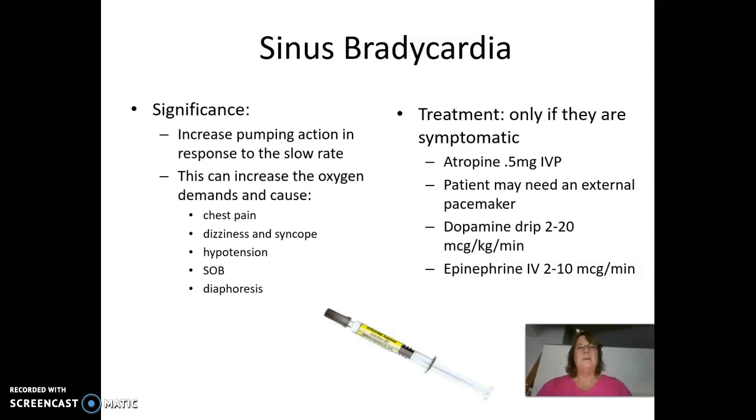Now, external pacemakers, I do want to say they're only meant to be temporary fixes until you can get a permanent pacemaker or a transvenous pacemaker in them. They're very uncomfortable for the patient because it's pacing them through muscle, through bone, through fat, and so it takes a lot of current to do that. And their whole body's jerking with the paced beat, and they usually need some sedation to go along with that external pacemaker. But it is a good choice if that's what's needed.